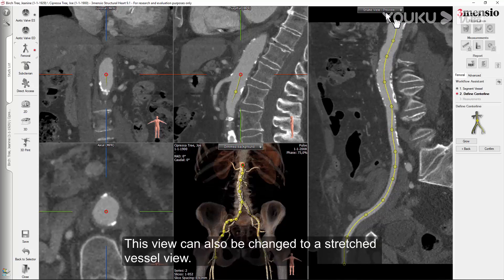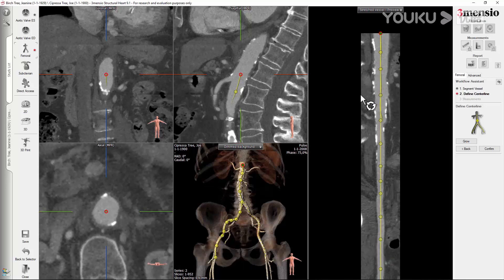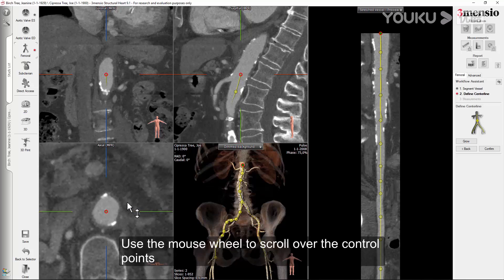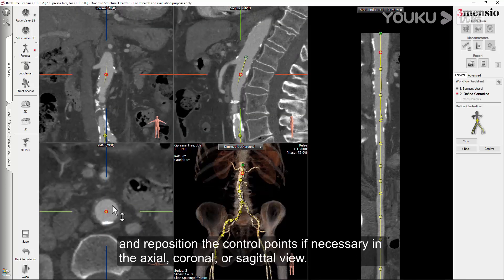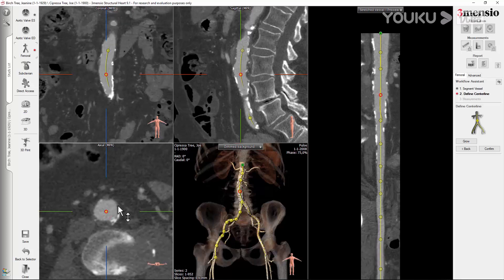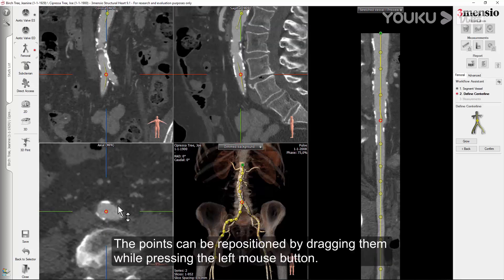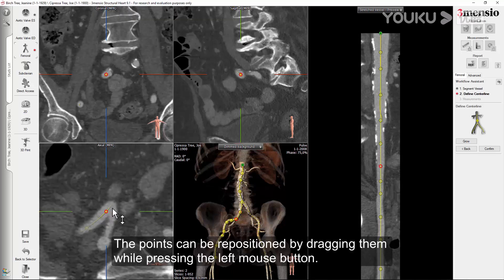This view can also be changed to a stretched vessel view. If all the control points are centered in the vessel, the vessel will appear straight in this view. Use the mouse wheel to scroll over the control points and reposition them if necessary in the axial, coronal, or sagittal view. The points can be repositioned by dragging them while pressing the left mouse button.